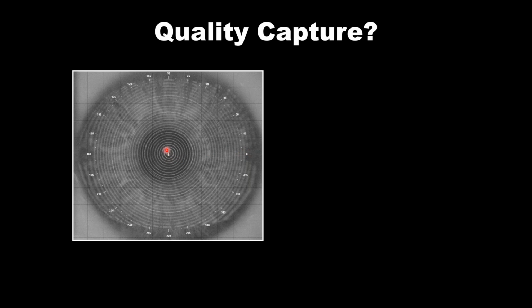So it begins with an understanding of the apex. And if you have error in any of these central rings, then that's going to create a topographical error for possibly the entire topography. So those central rings are the ones you're most picky and critical of.